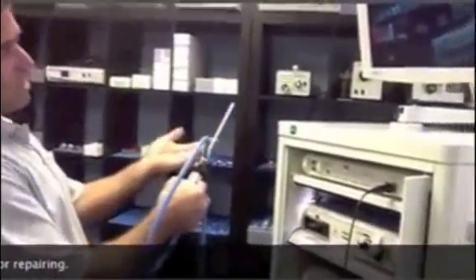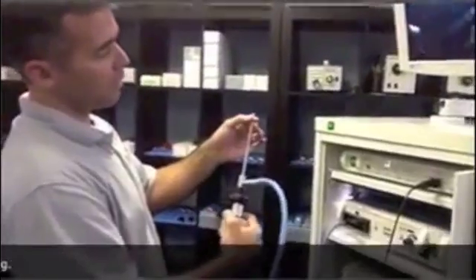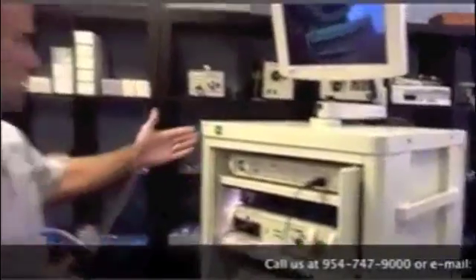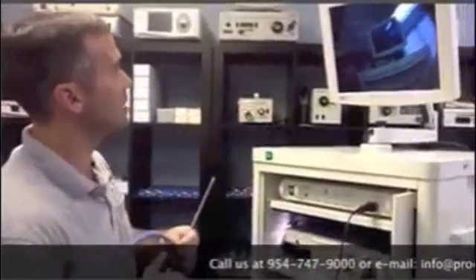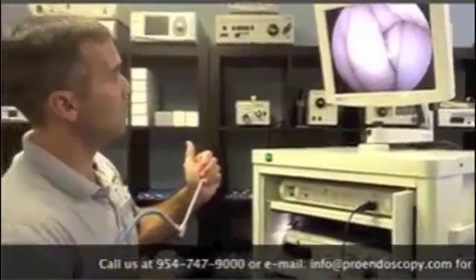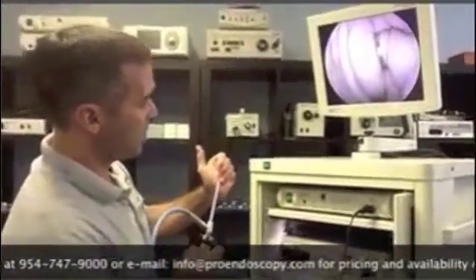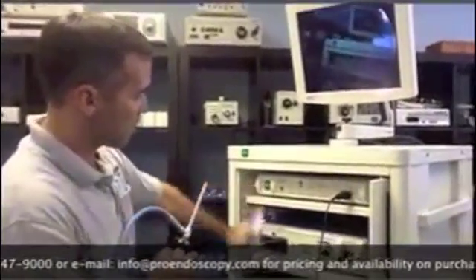I have a four millimeter here. They commonly use the 30 degree four millimeter. This is a tower that we have here in the office — a complete tower system. I connected it here for you so you can see the image. This camera is hooked up with the light source and camera.